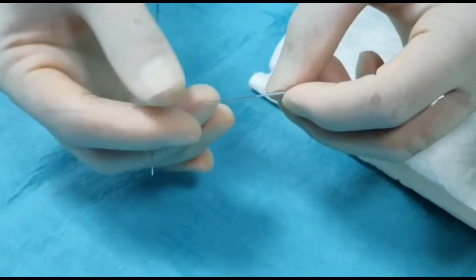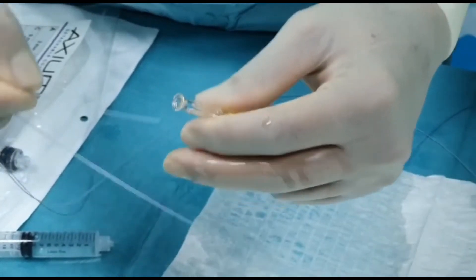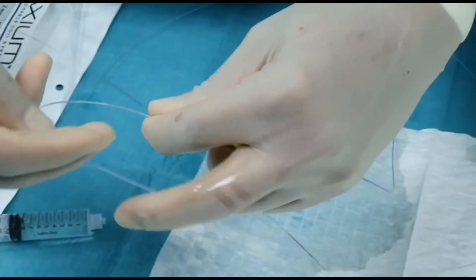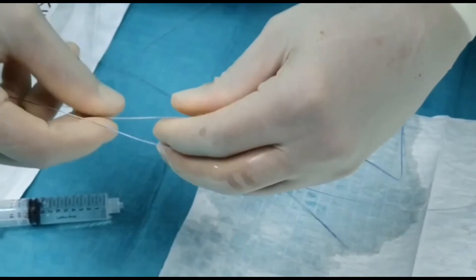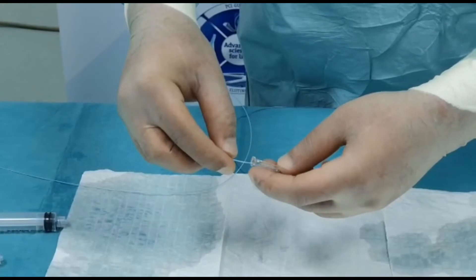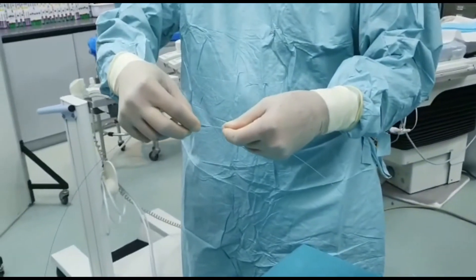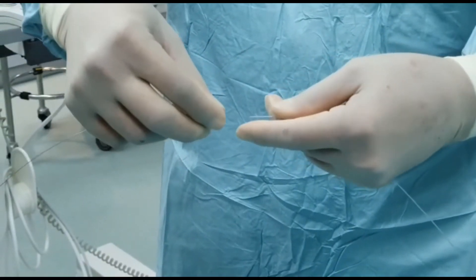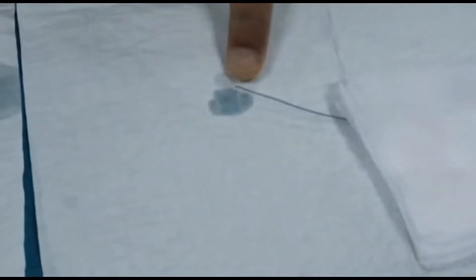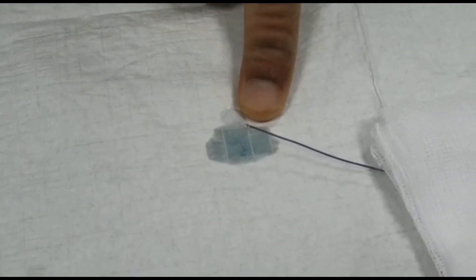Right now I'm going to put the tip of the hypotube into the hub of the micro catheter. I am holding it and gently pushing the coil. As you can see, the coil is going inside — the hypotube is in the inlet of the Finecross micro catheter. I'll ask my colleague Sadananda to push it. We keep pushing the coil gently.